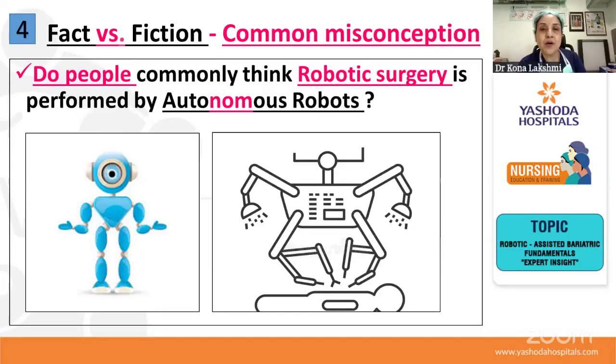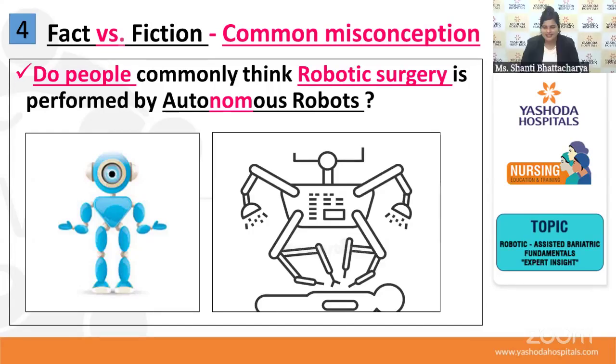So that robo is an advanced mechanization. We can say that is machinery for us, instrumentation, all the same thing. Where with one handle, movement of a handle, you are able to do the difficult task. So ultimately, who has to do? That individual has to do. But when technology helps you to do that procedure or work easily without putting a lot of stress on your general system, that is called a robotic surgery.